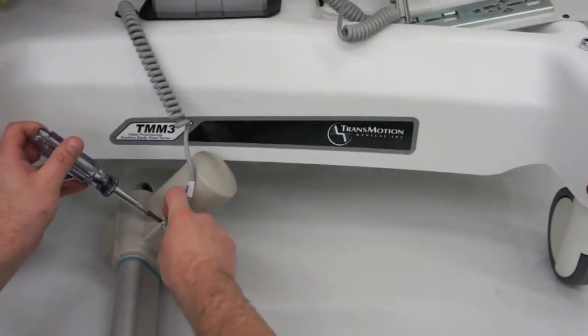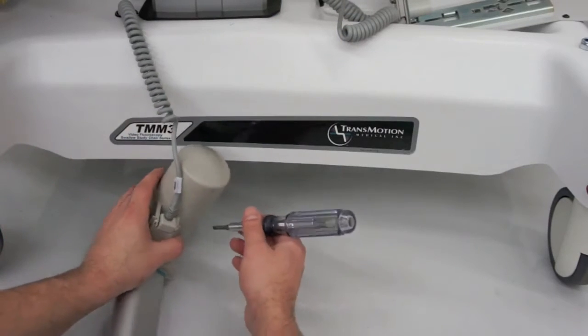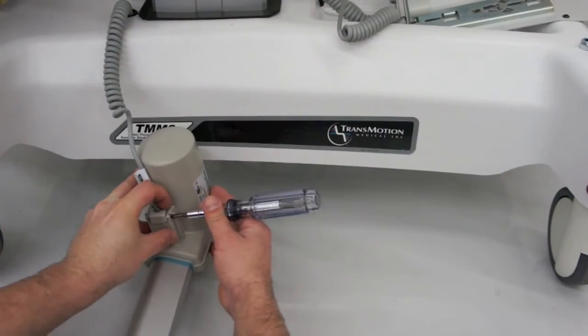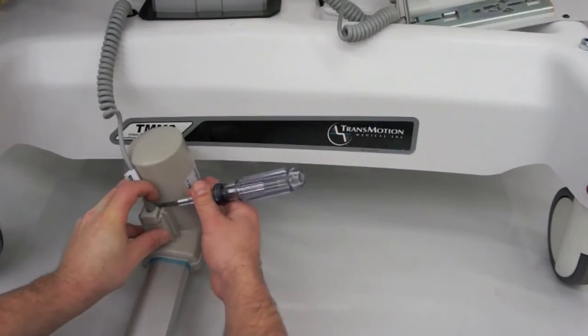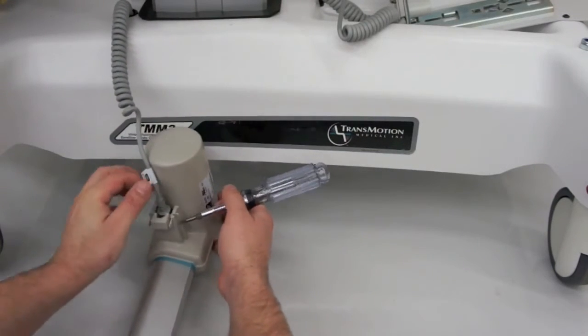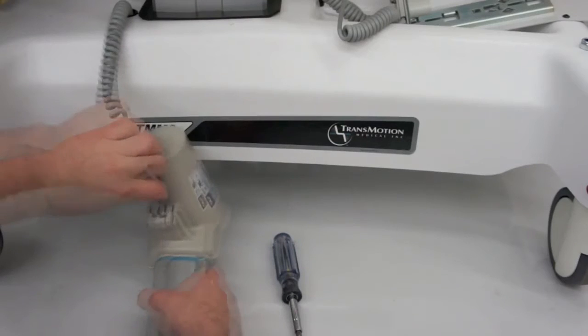With the actuator removed, take the flathead screwdriver and push the two locking points on the retaining clip. Push the retaining clip out with the screwdriver and pull on the cord closest to the plug.